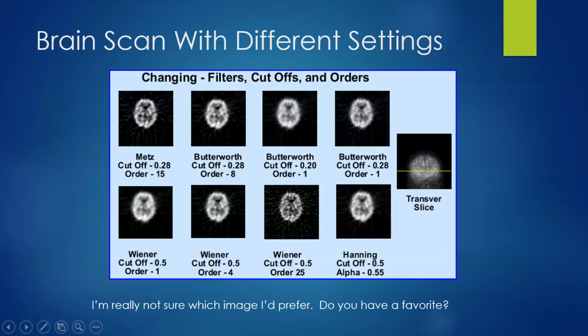And then finally, as far as just for your perusal assessment, this image I call the beauty lies in the eyes of the beholder. And my point being that you and your physician have to sit down and look at the myriad of different ways that you would process the data with different types of filters, with different types of cutoffs, with different types of orders, with different types of critical frequencies, and decide which one do you like, which one do you prefer.